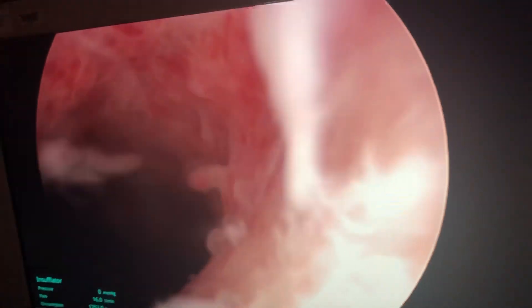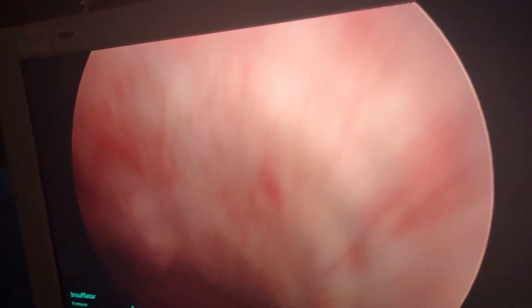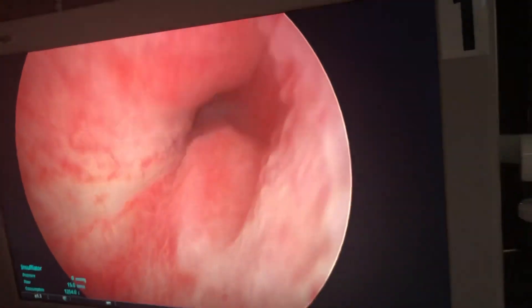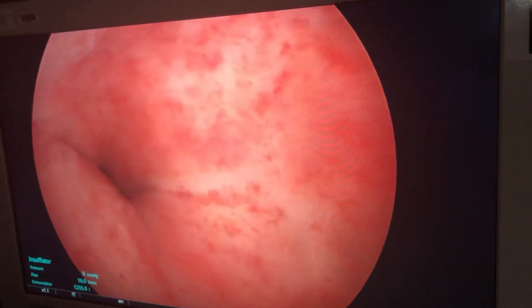There's a tiny little polyp thing here I'm going to get rid of while I'm there. And now we're going to go look inside the uterus. This is the cavity of the uterus called the endometrial cavity. You can see the openings of the tubes — there's the opening of the left tube, there's the opening of the right tube.